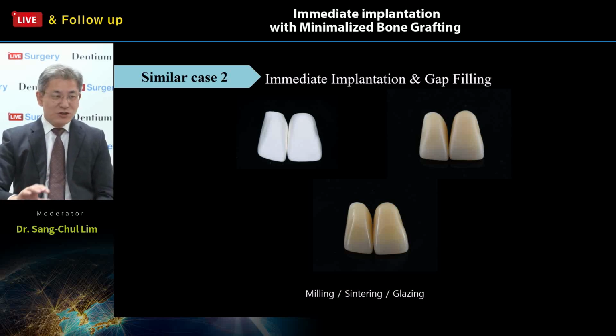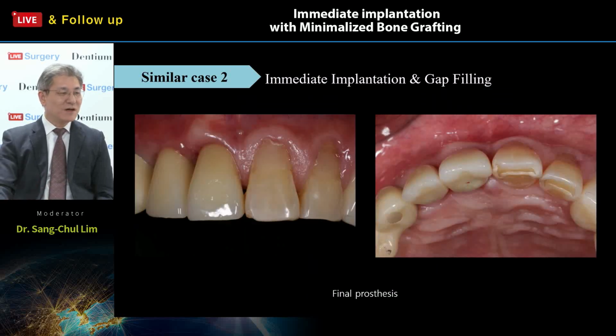Using the shading block of the zirconia, and just minimizing the staining is enough to make a final restoration, even though it is a zirconia final restoration. So the delivered situation in our patient's mouth, number 11 and 12, central and lateral incisor. So what about this? A simpler way, however, the outcome is greater.